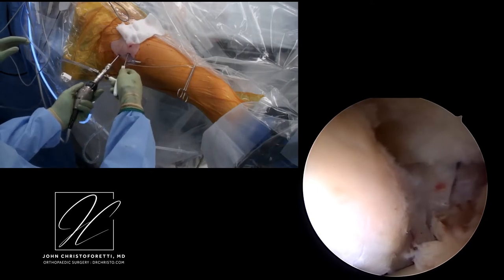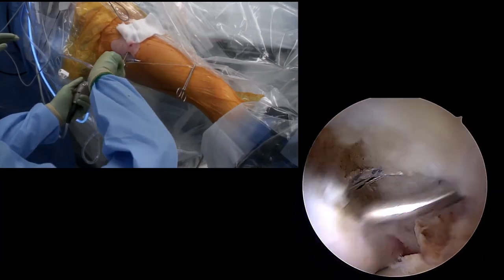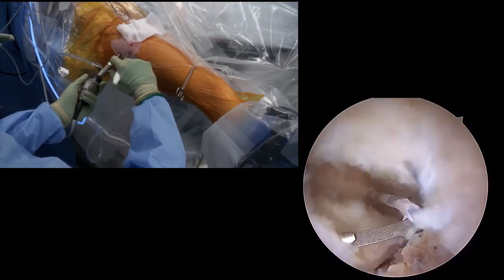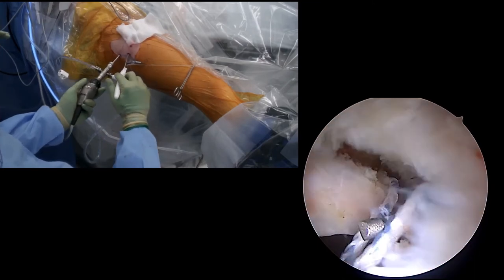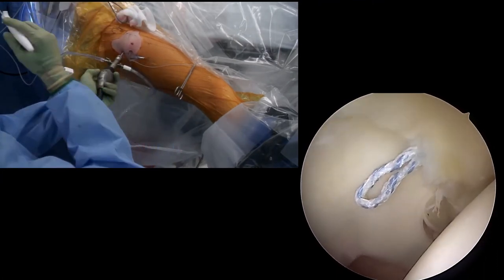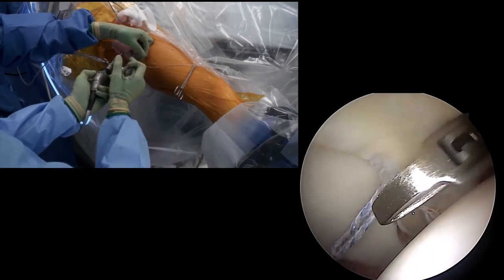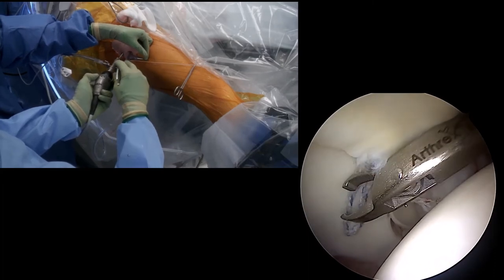Next we use a small antegrade passer penetrating through the base of the labral tissue with the knotless anchor stay suture. We visualize in the arthroscopic image the grasping of this stay suture — the white striped sutures are used to pass the suture that will stay with the repair through the deep construct in the bony tunnel. First we check tension on the blue stay suture by past-pointing into the joint. Next we use the extra length of suture to pass on the labral base side of the detachment, then use the ring grasper to more securely pull the first passage through to avoid excessive tension on the knotless repair construct — an important step, as antegrade passing devices can cut sutures or make a difficult passage on the second pass.